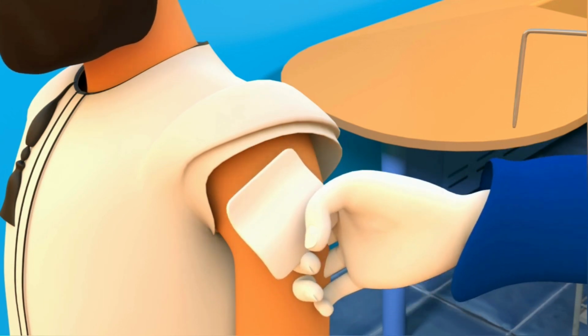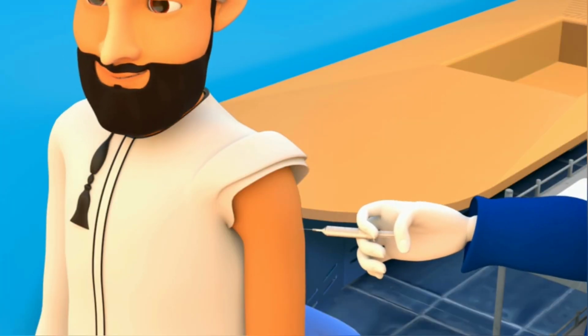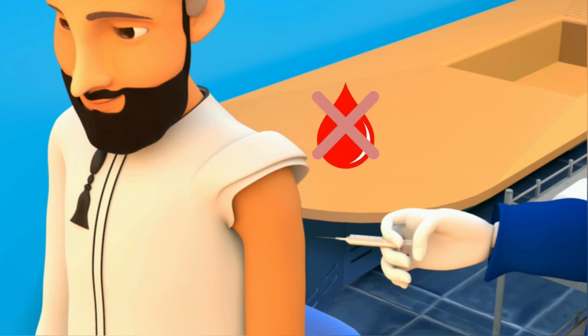Stretches or spreads the skin flat between the thumb and index finger to create a firm surface and to isolate the muscle. Inserts the needle quickly and smoothly deep into the muscle at a 90-degree angle. Aspirates for blood return if appropriate. If no blood appears, injects the medication slowly. If blood appears, stops the injection and prepares a new syringe with the medication and injects into another site.